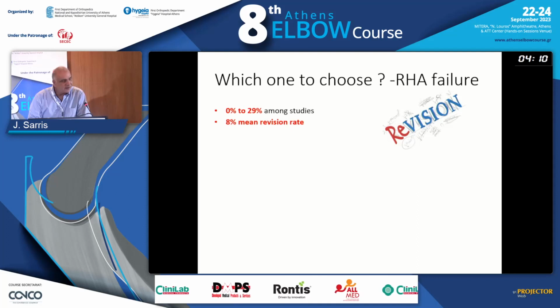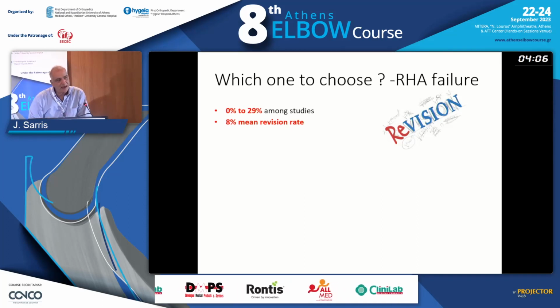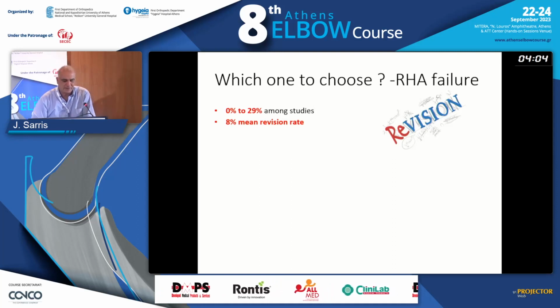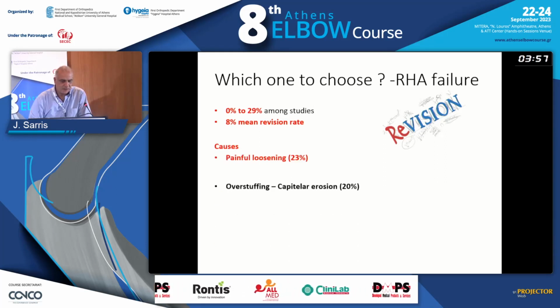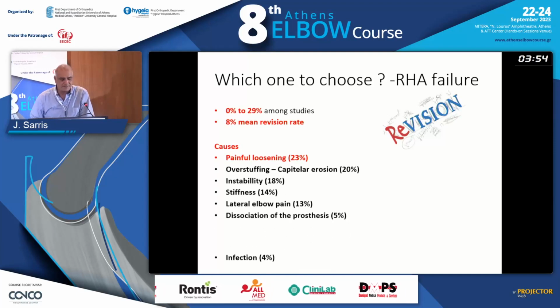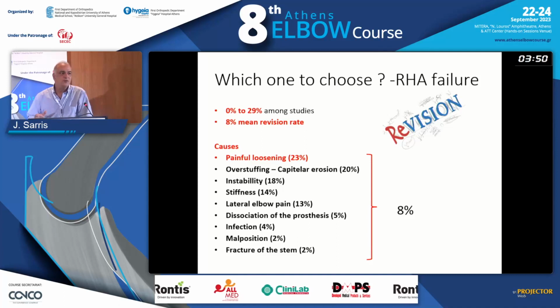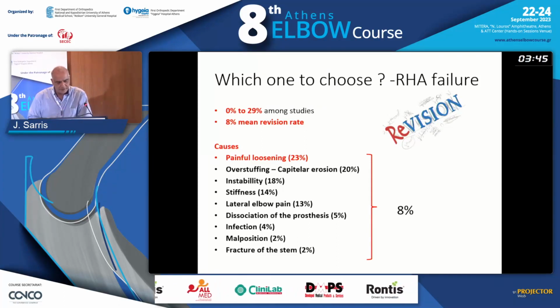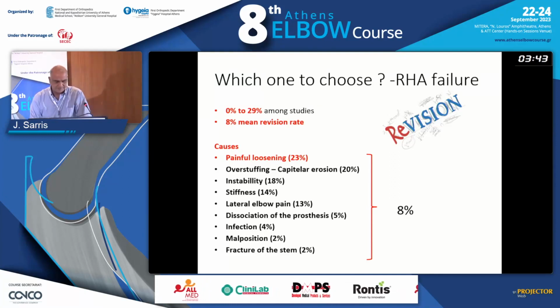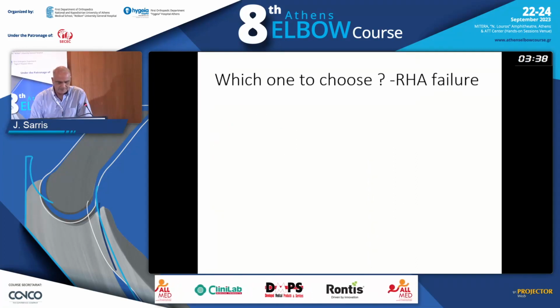We're still in that section, and we have to see why radial head arthroplasty fails. And it looks like 8% is the mean revision rate. The cause is primarily painful loosening, and here we have to define, is it pain with loosening or is it painful loosening? And sometimes it's very thin to understand the difference. Other causes are overstuffing, instability, and so on.